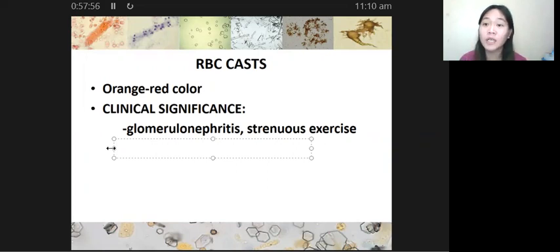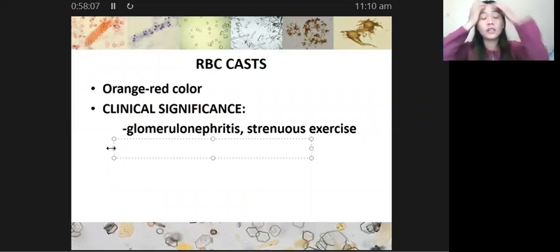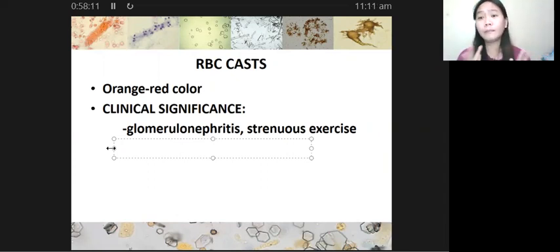Specifically, yung dalawang general parts ng nephron natin ay si renal corpuscle, which includes your glomerulus, and then your renal tubules. Tama? Okay. So, ma'am, paano natin masisiguro na yung glomerulus ang problema natin at hindi yung ibang parts ng ating renal tubules? Kasi pwede din naman na bleeding siya sa renal tubules.